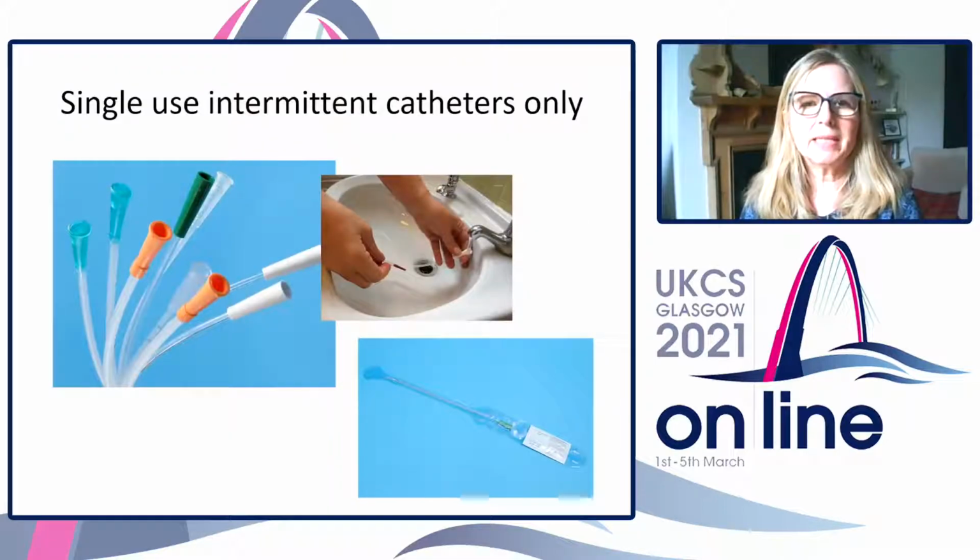In the early 1980s, a major catheter design change occurred with the introduction of catheters with a hydrophilic coating that becomes slippery when soaked in water for short periods. These catheters were for single use only. At the time, plain uncoated catheters were still available, which could be reused by individuals catheterizing themselves.